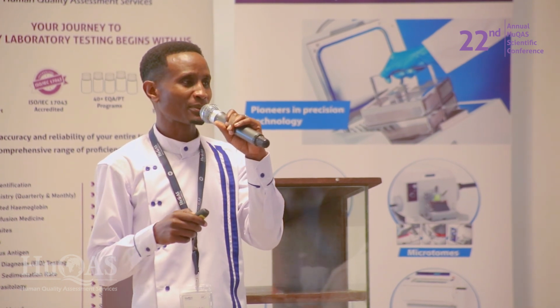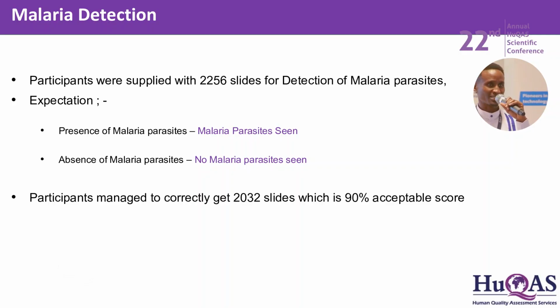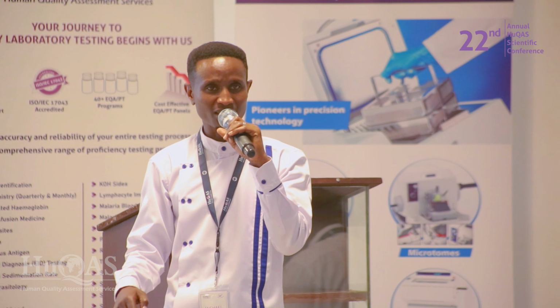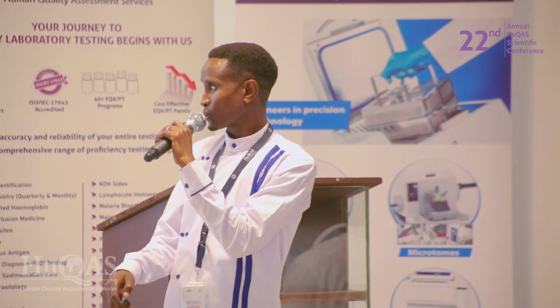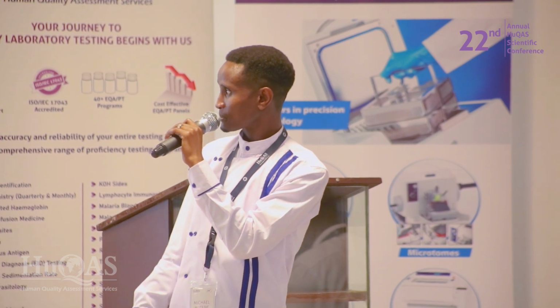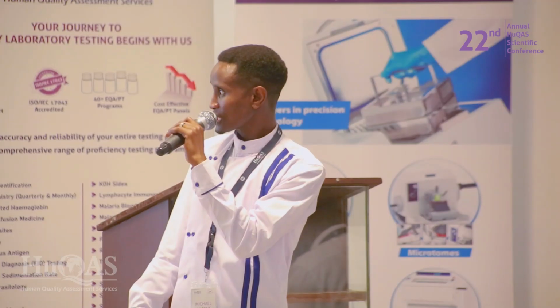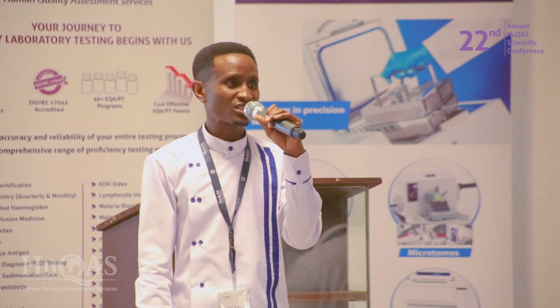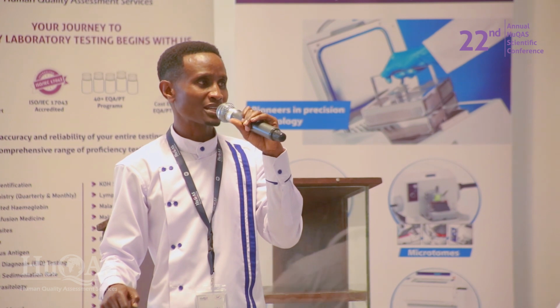But for EQA, we supplied both positive and negative cases, so that these facilities can tell us whether they have malaria or they don't have malaria. They speciate, they quantify where required. For this detection, participants were able to get an acceptable average score. Of course, this is supposed to be an average score of 90%. That means 2,032 slides were picked correctly as required.